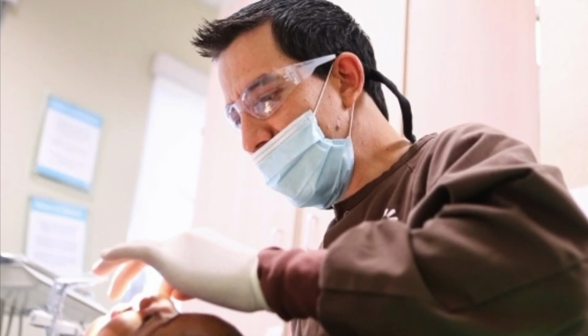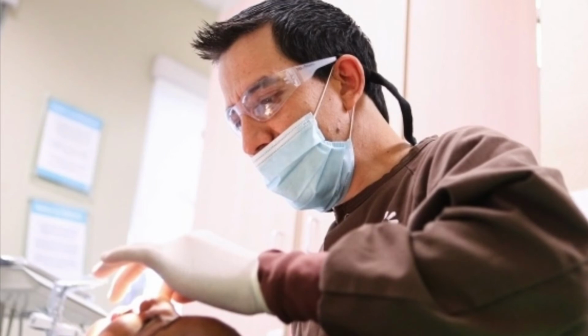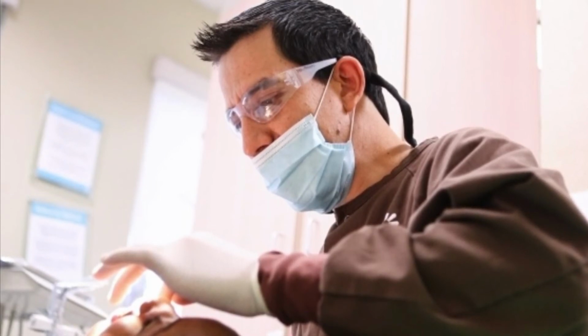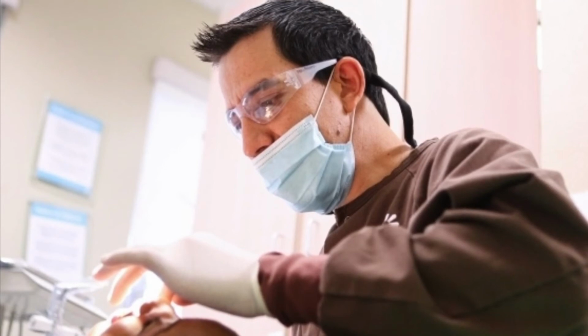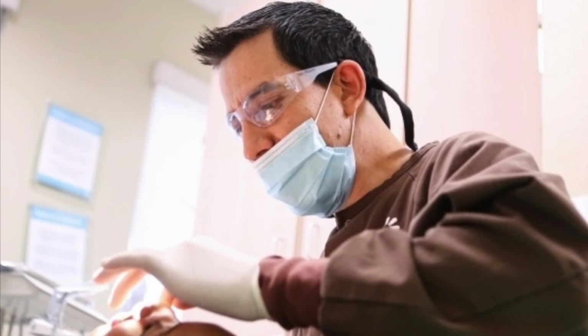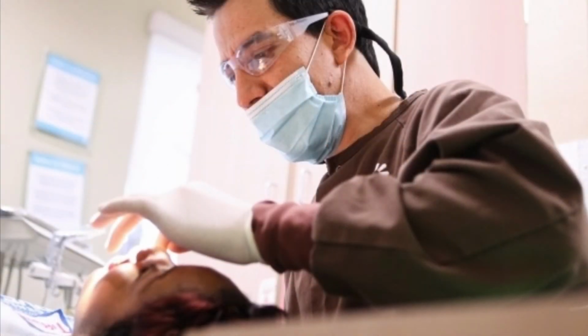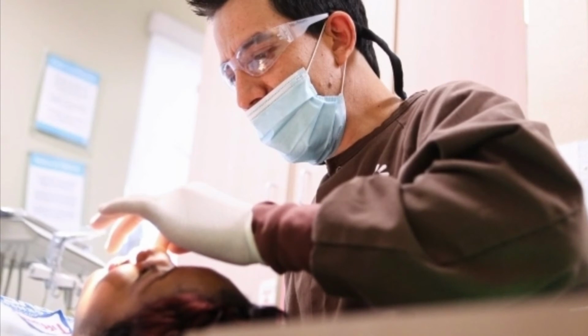Again, it is a slice of anatomy that is captured and synthesized manually or using an algorithm. Cone beam CT is relatively new. Cone beam CT is CBCT, not only CT. It is a relatively new diagnostic imaging modality that has been recently added to the endodontic imaging armamentarium, and it uses a cone beam instead of a fan-shaped beam in multi-detector computed tomography.